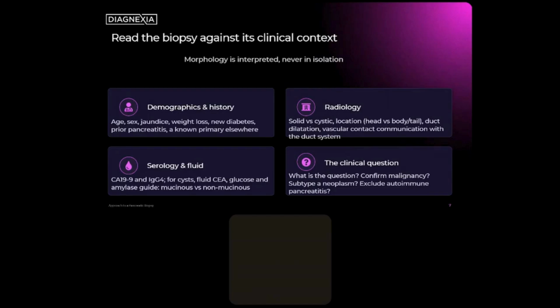Now, one of the things I should highlight here is that many cases now, especially of pancreatic cancers that are irresectable or borderline resectable, are subjected to neoadjuvant chemoradiation. And that in itself induces changes in the pancreas. So when the pancreatectomy arrives and you start to look at the microscopy, just be aware of that background as well, because neoadjuvant chemoradiation induces cytologic and structural change in the pancreas of its own, and not to be confused with a cancer.